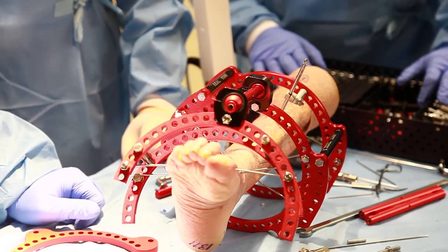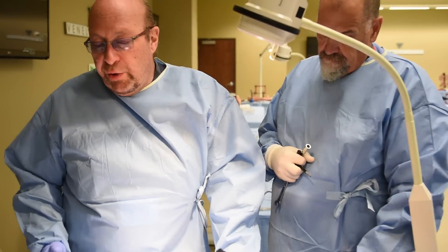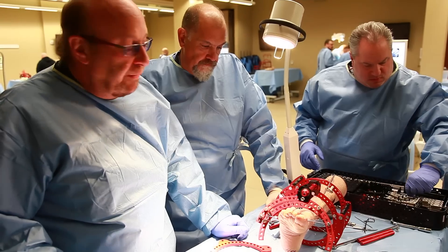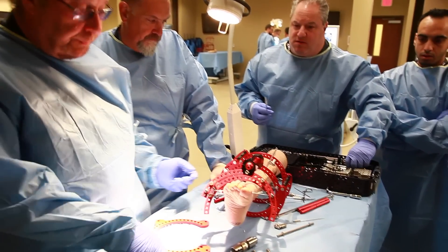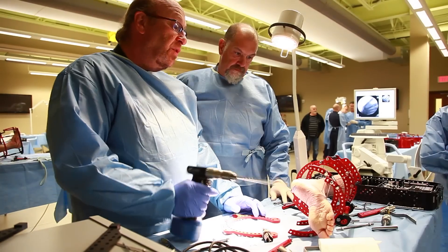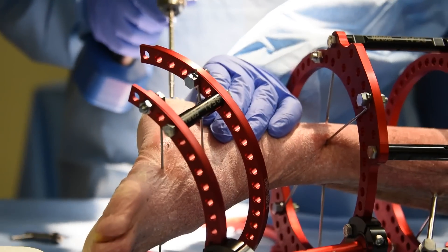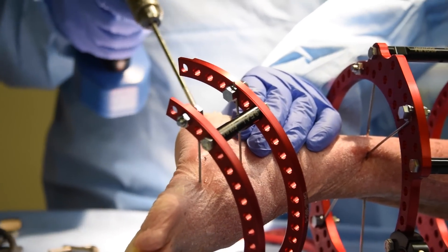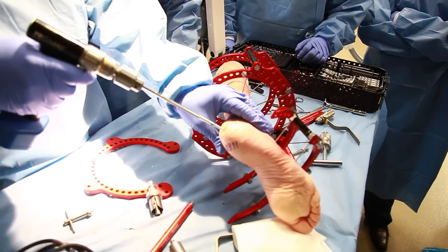The technique involves taking a half pin through the posterior aspect of the heel, elevating and reducing Böhler's angle and the critical angle of Gissane. If you can do that, you should have a decent result. This pin is going to go posterior in the center and body of the calcaneus. It should be done under fluoroscopy, with care taken not to violate any of the fracture sites.